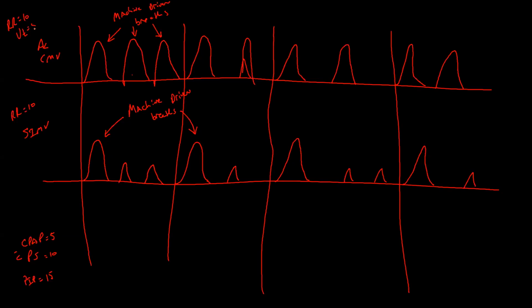Okay, so that means this is 500 and this is 500 and all the way across, they're all 500. Right. And in here we'll say tidal volume equals 500. So here we have 500, here we have 500, and so forth.